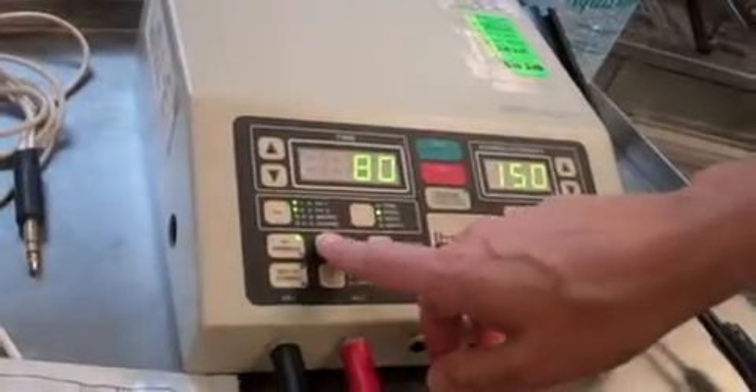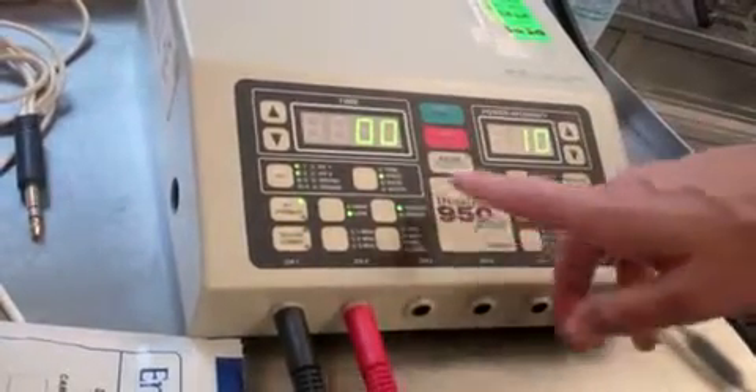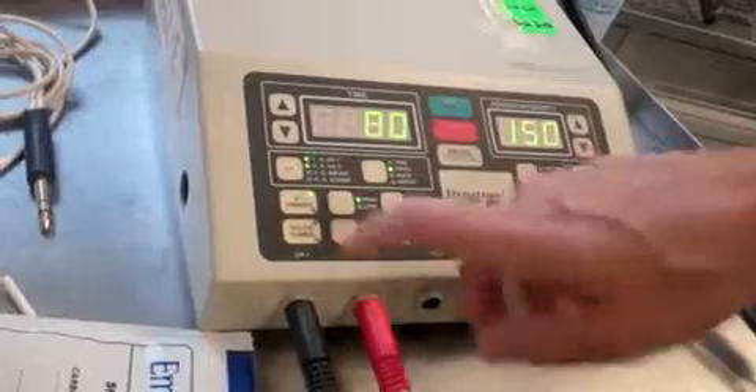On high, our frequency is 80 to 150 pulses per second. If I switch it to low, it'll modulate between zero and ten pulses per second. For sensory level, we'll put it on high.